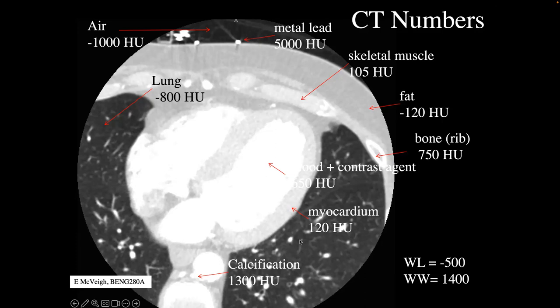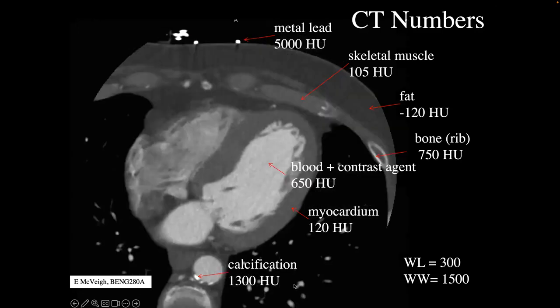And so normally, like those clinical examples we saw at the beginning of the course, when we're looking at COVID in the lungs and things like that, radiologists require two different displays. They'll display an image like this to look at the structure in the lungs, and then they'll display an image like this to look at the structure of the tissues. To get the detail, it's very hard to put all of that dynamic range in one picture.